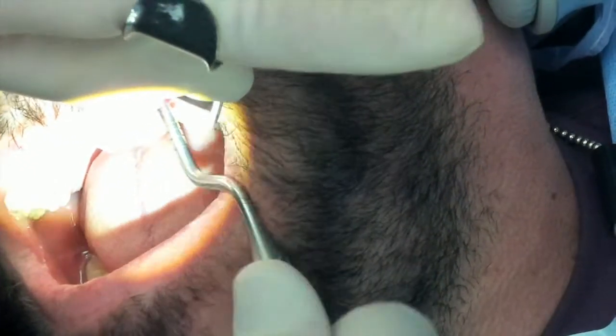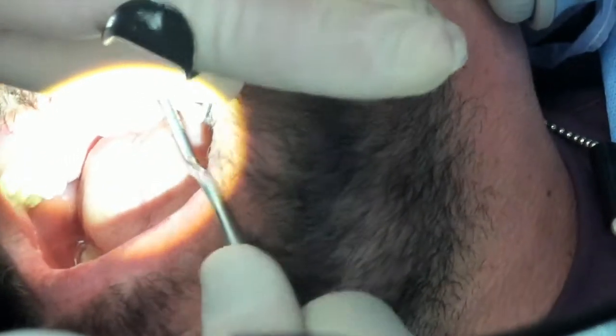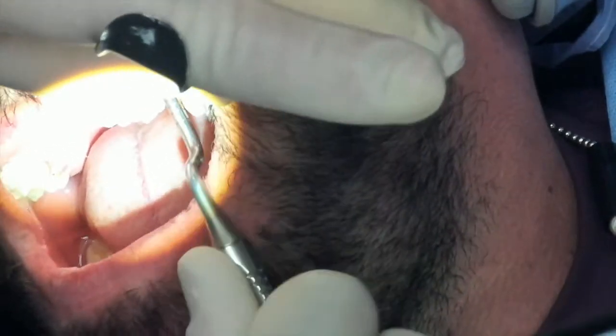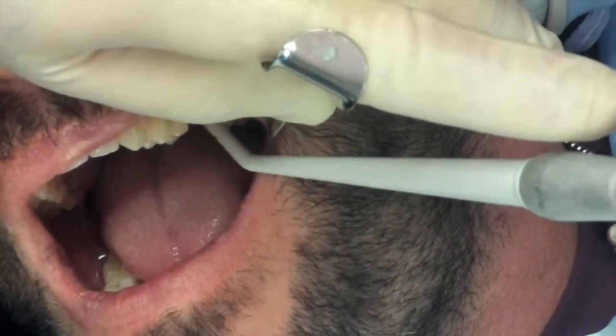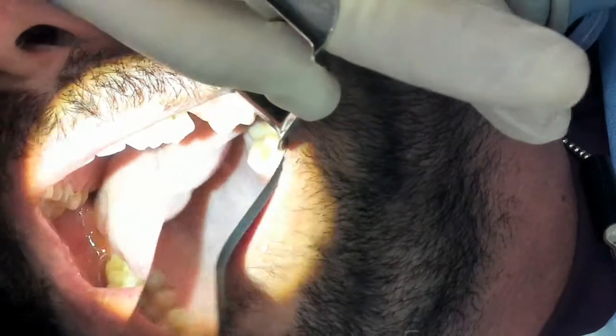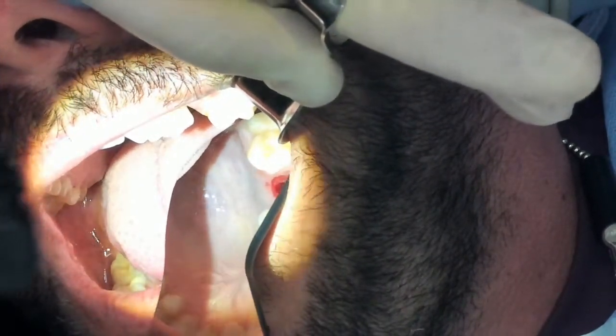A lot of pressure now. Okay, I'm not ready yet. Now, there's all different burrs. There's the versatile burrs, the osteotomy preparation, other options on how to manage sites like this. I prefer, look at there. You see the floor of the sinus? Beautiful. Okay, we're still only at 8 millimeters.